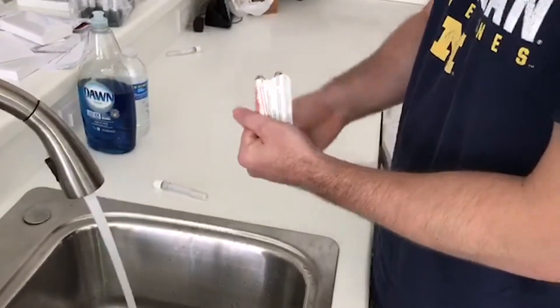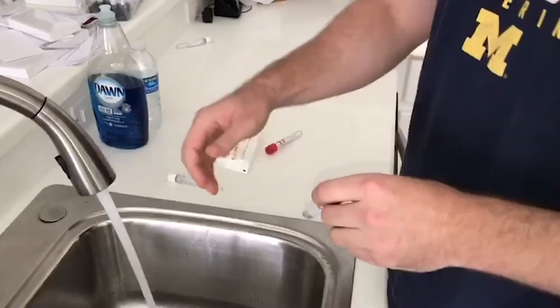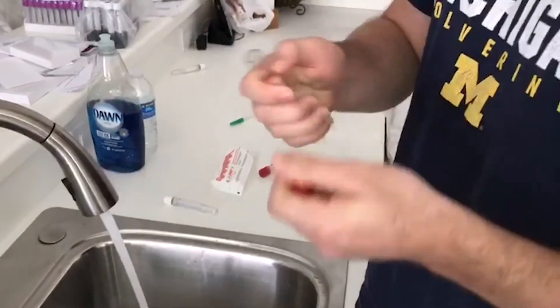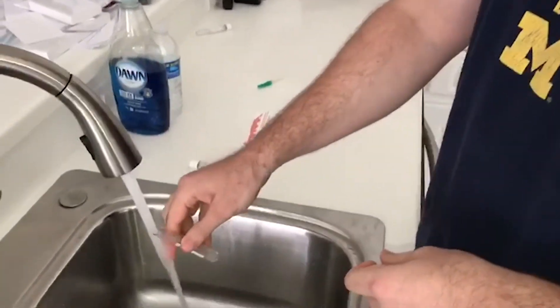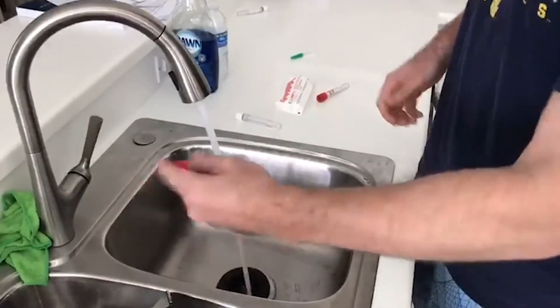These are APRF tubes from 2020 — relatively new. The batch on these is 18-10-GA, so one of the more recent ones. Same thing: pop the seal off, you can hear it, and just put a little bit of water in there.